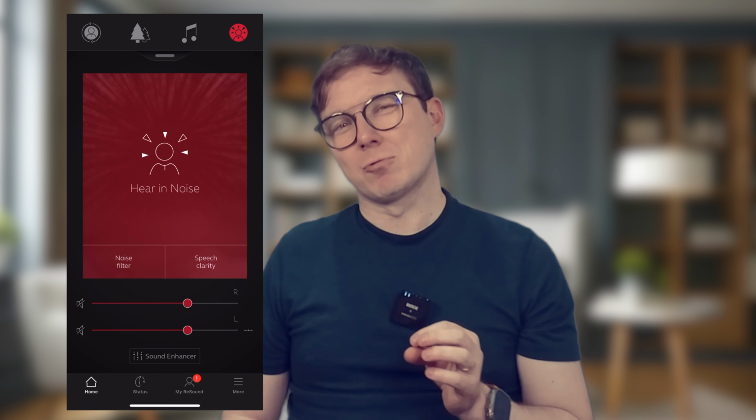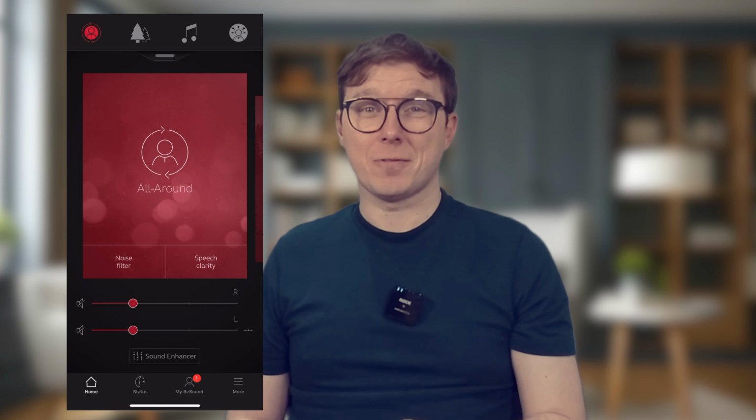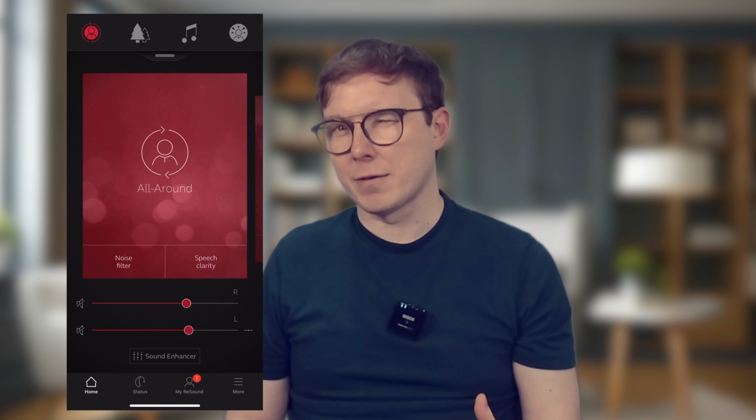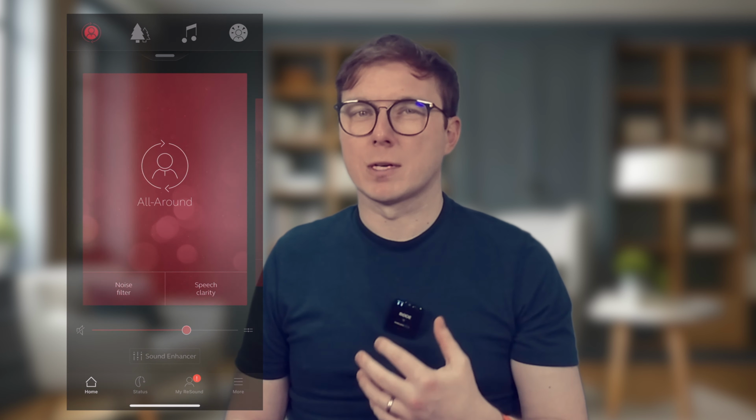The app is responsive on the iPhone. It's a known fact that Android users don't fare quite as well with Omnias as they are made for iPhone. We just tend to experience more connectivity issues with Android. I haven't tested the Nexias with an Android, but on the iPhone it is definitely an improvement in terms of stable connectivity. The app is one of, if not the very best on the market.